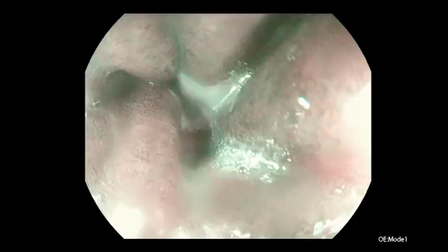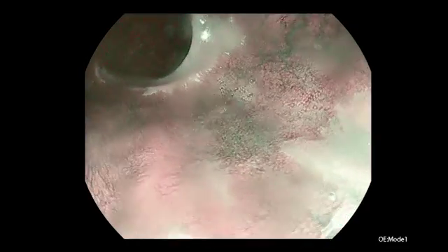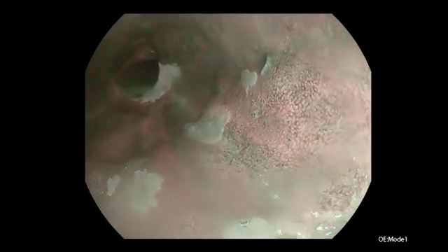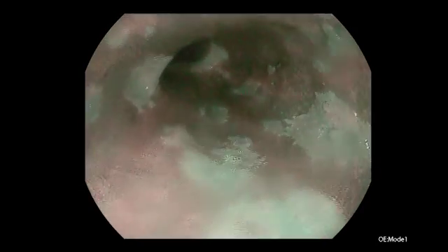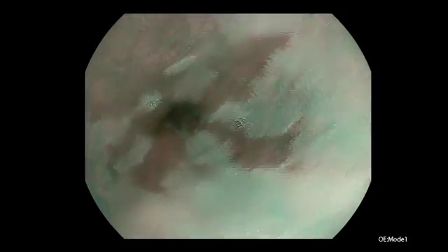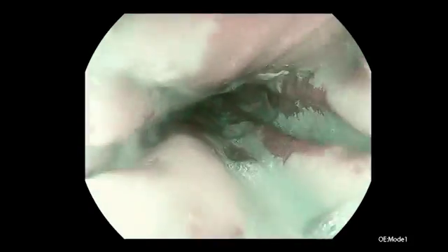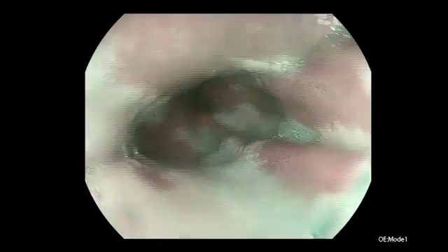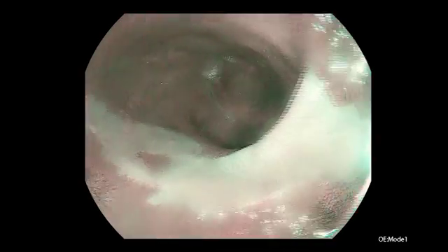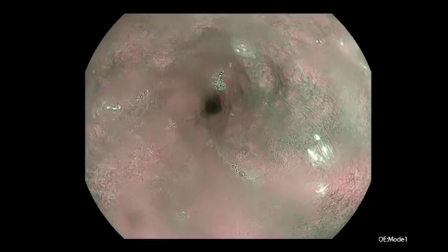Here we see the squamous epithelium, but the area of high-grade dysplasia is not visible. I will perform the resection — a hemicircular resection of this Barrett esophagus.